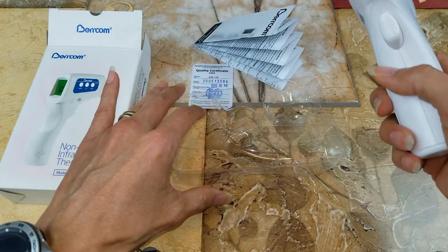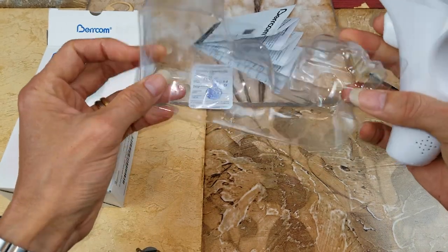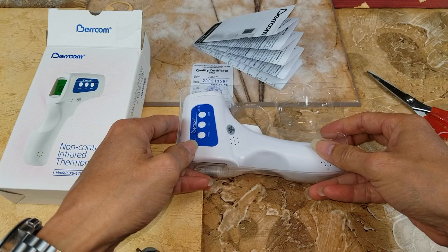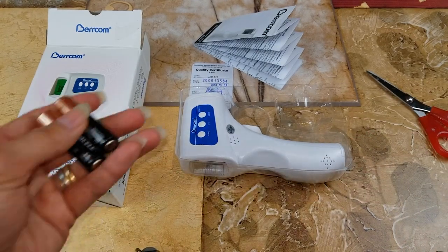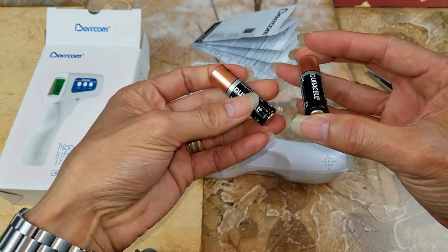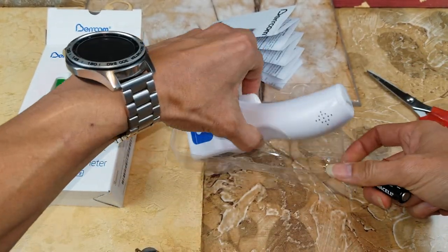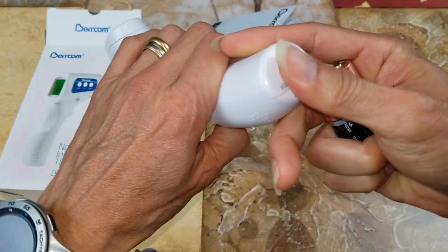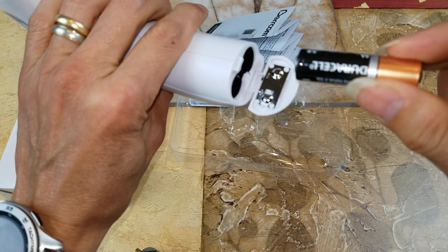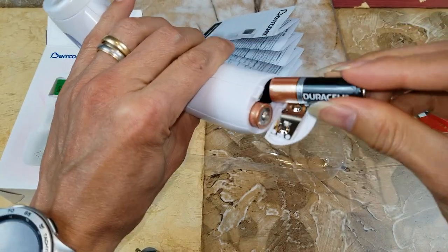Let me go ahead and get the double-A batteries first and test this out for you guys. I just got two AA batteries from one of the controllers. Go ahead and put them in — the positive goes this way and the negative is on this side.